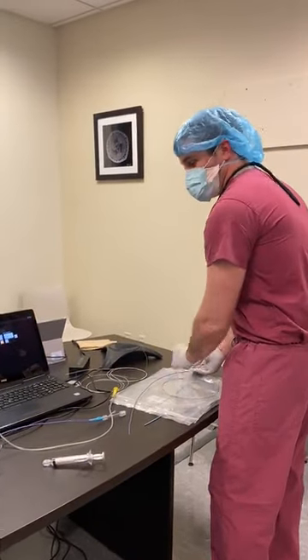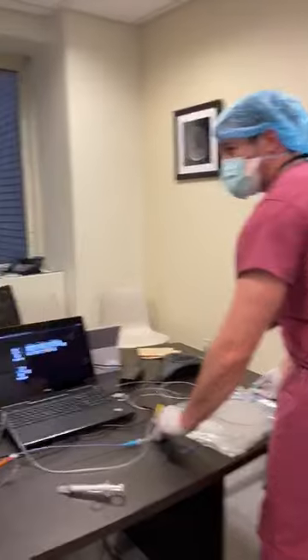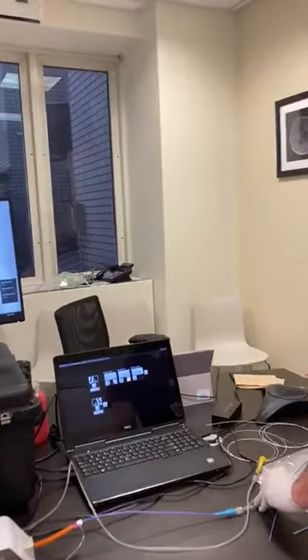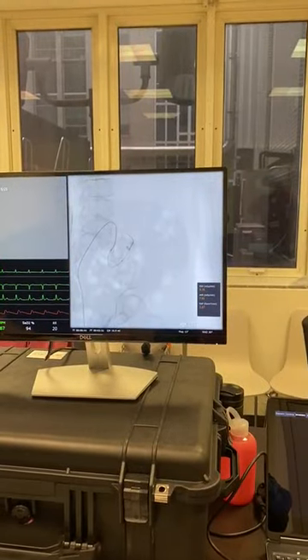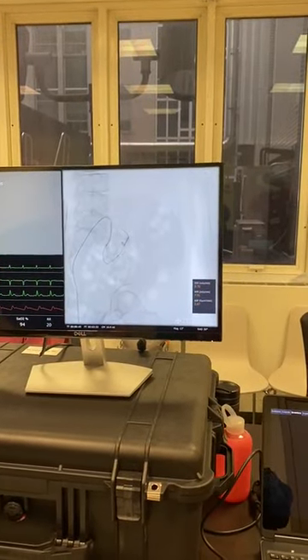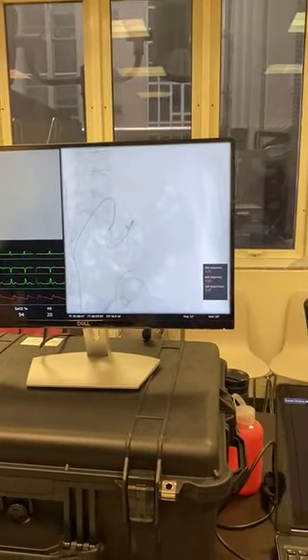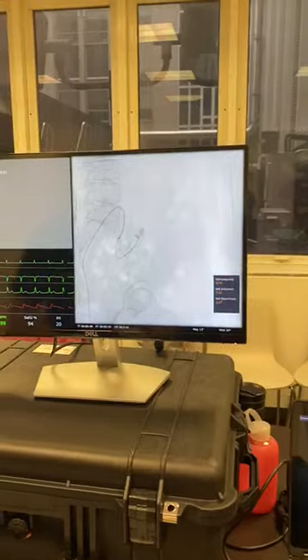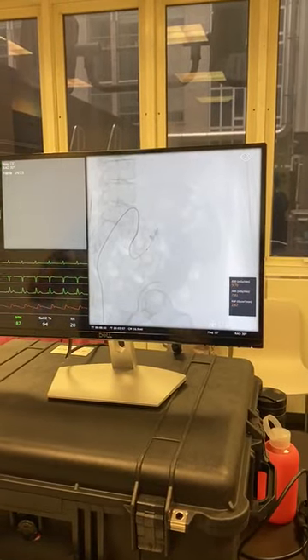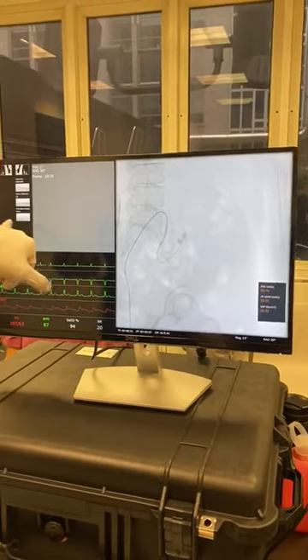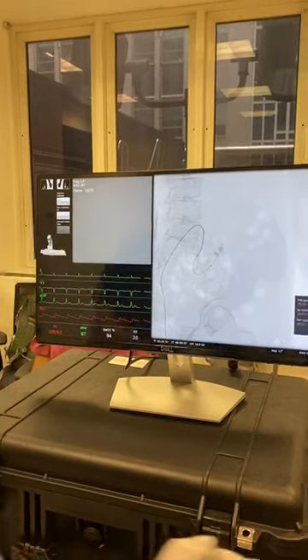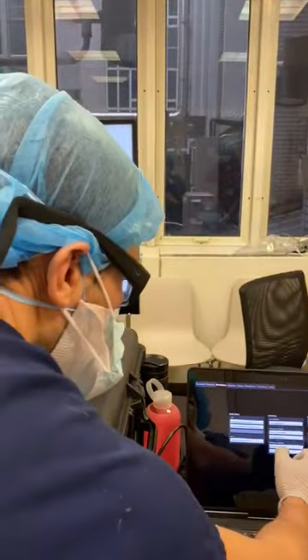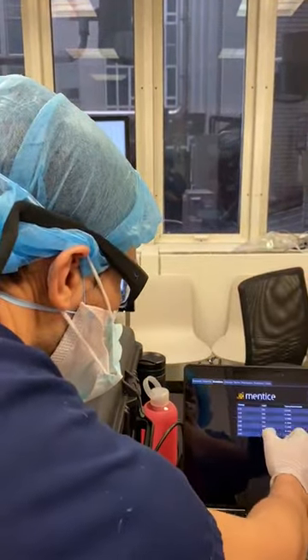Do you want to tell him what you're doing? I'm going to get the wire and the catheter past the area of extravasation to start my coiling. He's going to pull the wire back — our wire is actually going to become our pusher for our coil. So once that's deactivated, I'll help him out and select the coil.